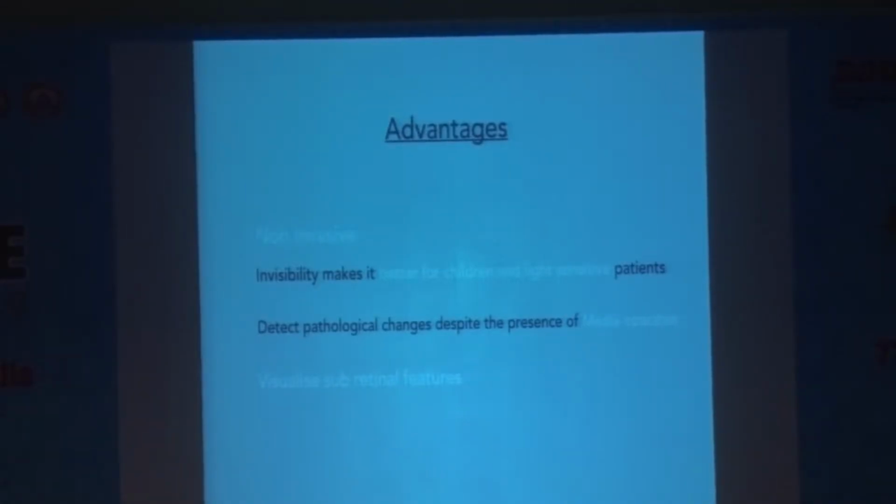So the advantage is that it's a non-invasive technique, and the invisibility makes it better for children and light-sensitive patients. It detects pathological changes despite the presence of media opacities, and it helps to visualize subretinal features.